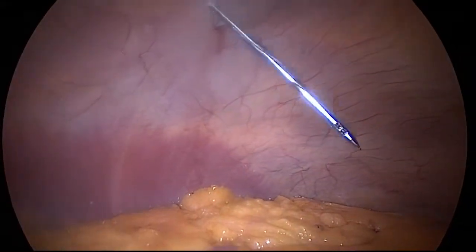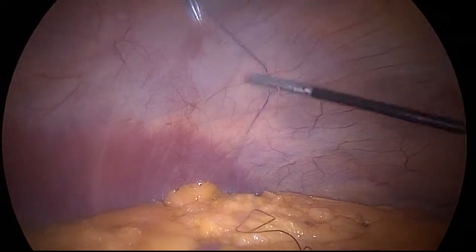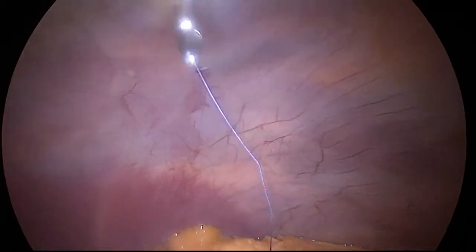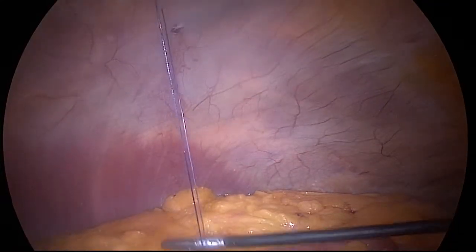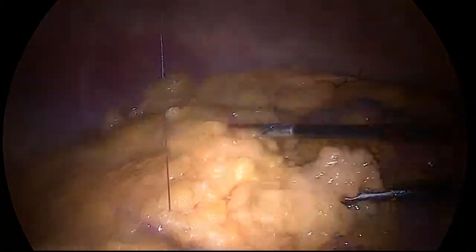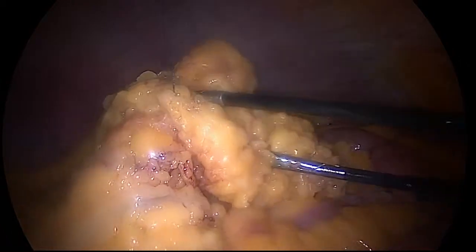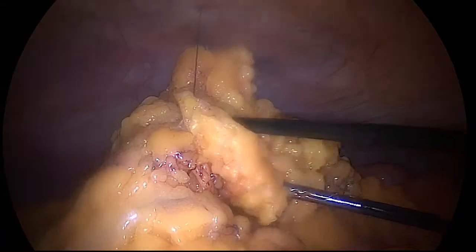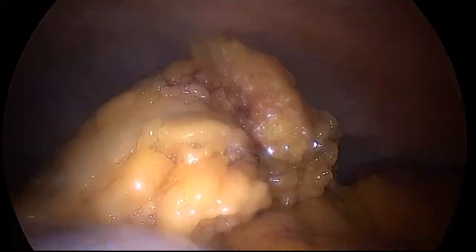Once the omentum is mobilized, we transfascially place a suture for our omentopexy. As the omentum is placed into the suture, the peritoneal cavity is desufflated while the omentum is being tied up to the anterior abdominal wall. This secures the omentum in the upper quadrants, minimizing any obstruction of the catheter.